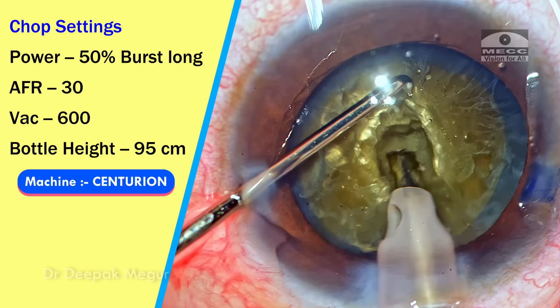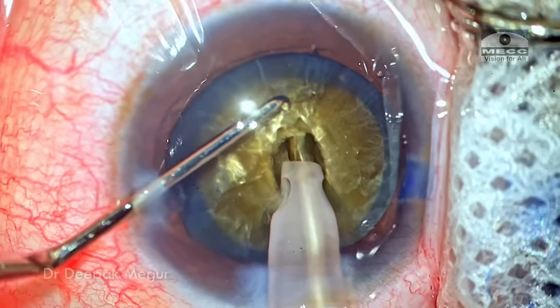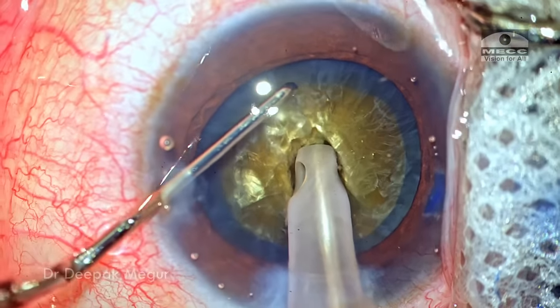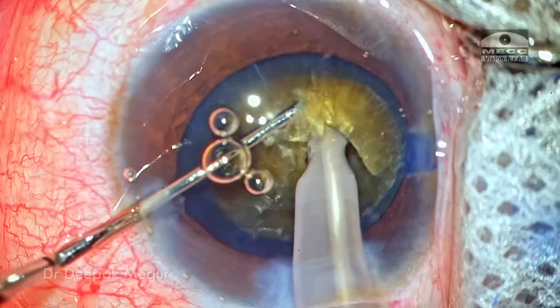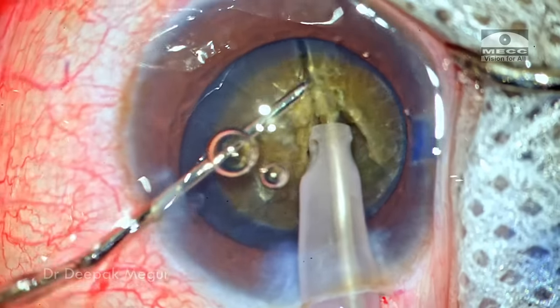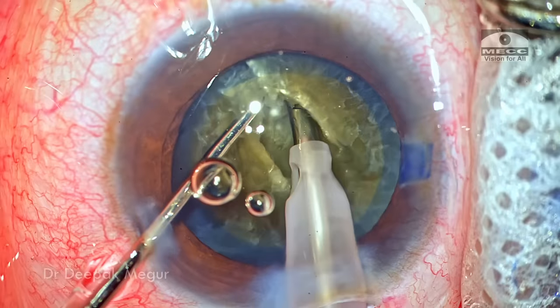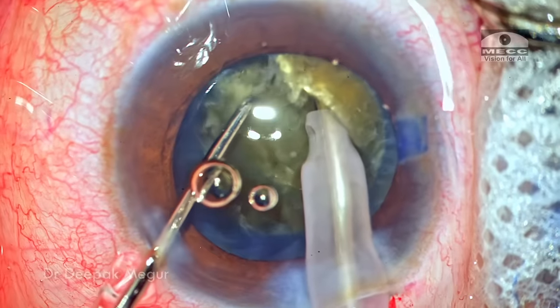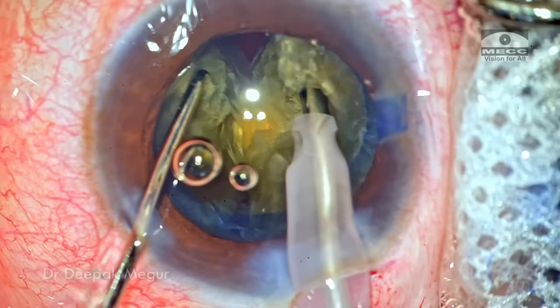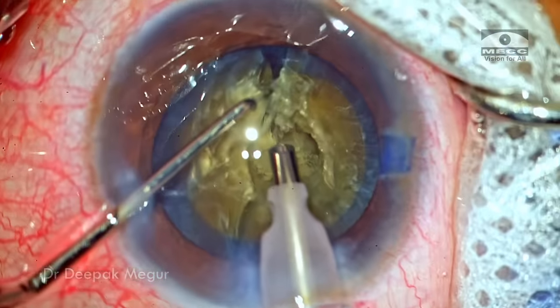Now is the time to start doing the vertical chop. The settings are changed to longitudinal burst mode. I ensure that the tip is completely buried, but as I attempt the vertical chop we can see that the nucleus is experiencing torque — the grip is not great. The grip slips so the separation is not complete. The central portion of the posterior plate is extremely thick and tenacious and is refusing to give way.